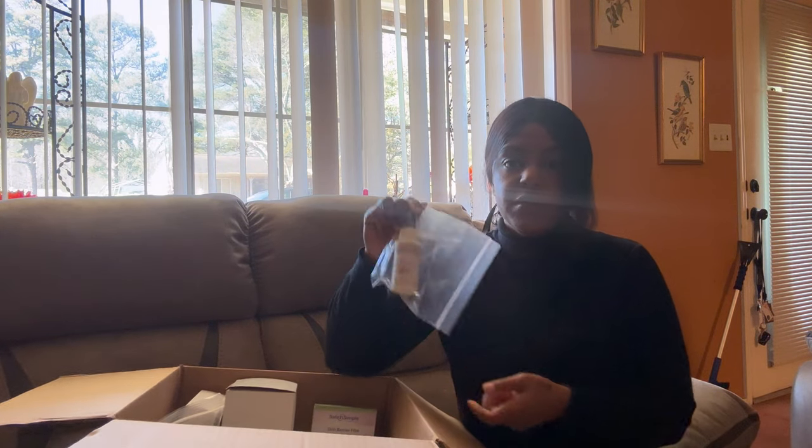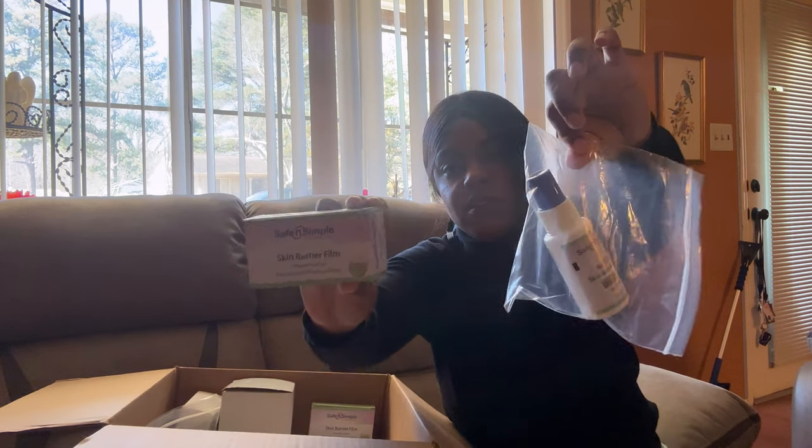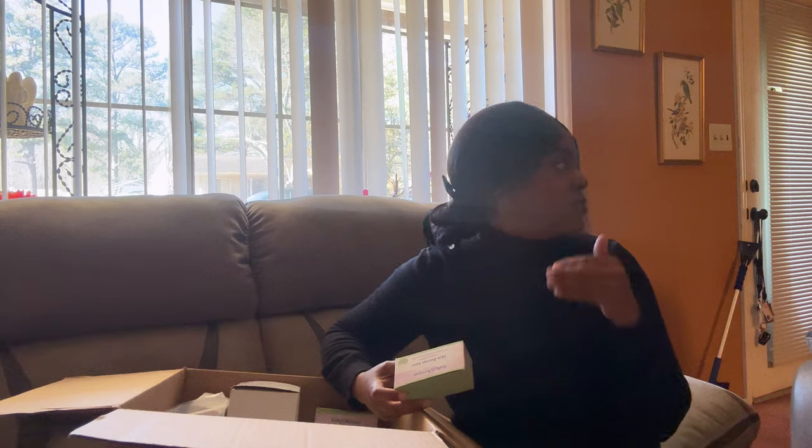Next I have the no-sting barrier film. I got this in the spray as well as the little wipe. This is a protective film that serves as a barrier between your skin and your bag, seal, or paste — whatever you put on next. You put this on first to protect your skin. It's also a little bit sticky, so it provides a bit more adhesive. I ordered a lot of those.